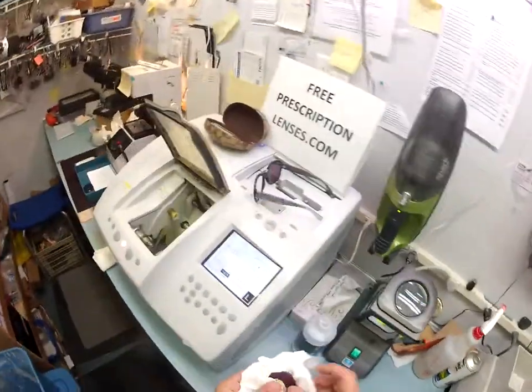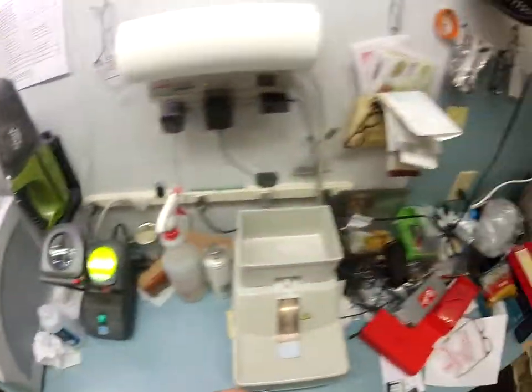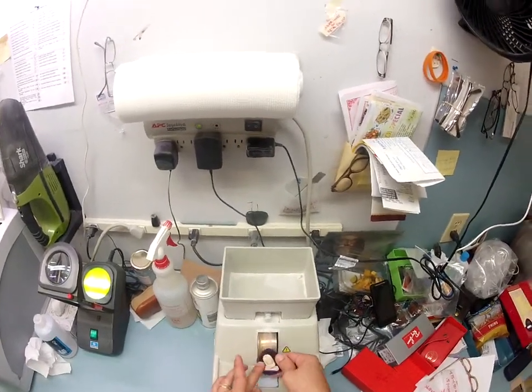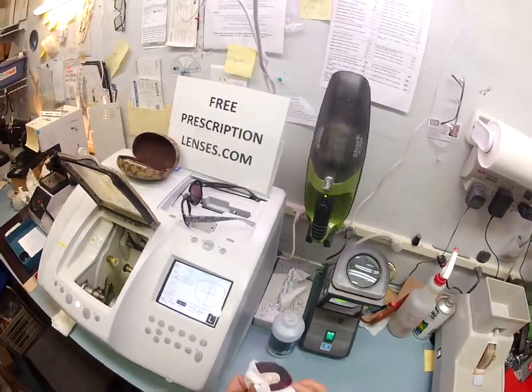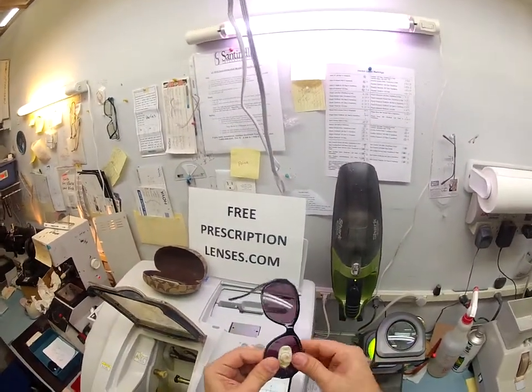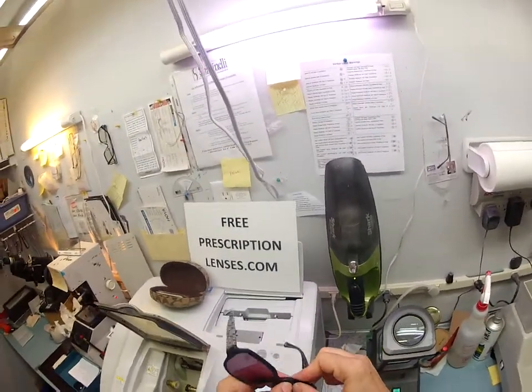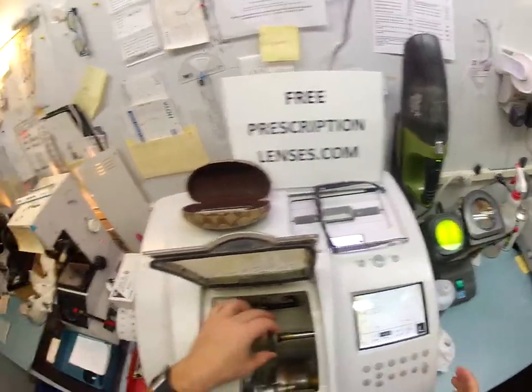So, got to dry it off. And my hand stone is completely flat. I can put my hand on it while it's running. It just uses friction to take away those rough edges. Dry everything off again. And then I'm going to tuck this in at the corner closest to me, and then using my thumbs, press down at the nose. Hang on, I got a weak thumb. Nope, it doesn't want to go, so I'm not going to budge it. I'm going to take 1/10 of a millimeter off.